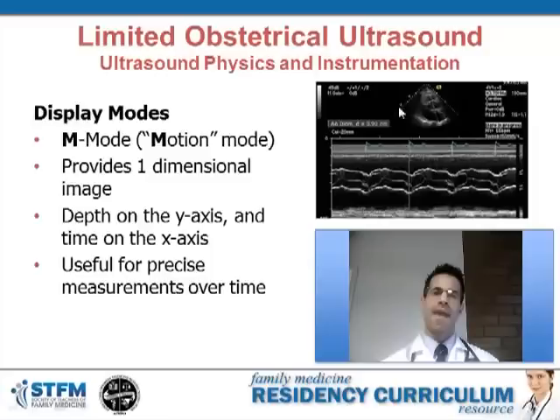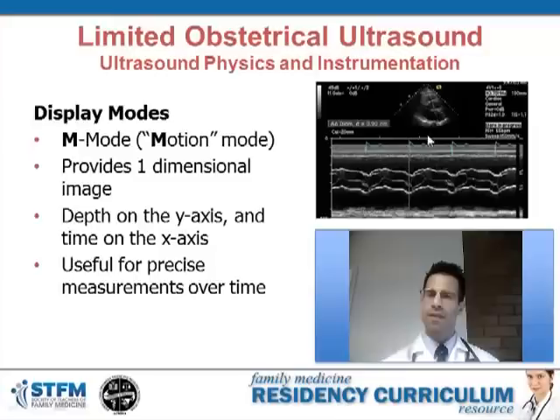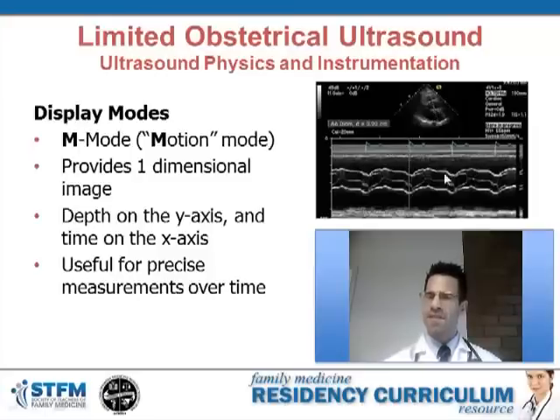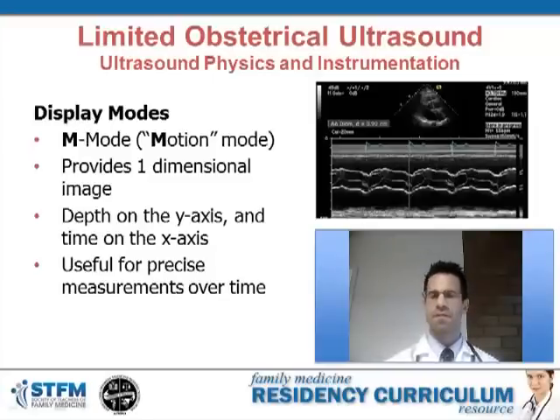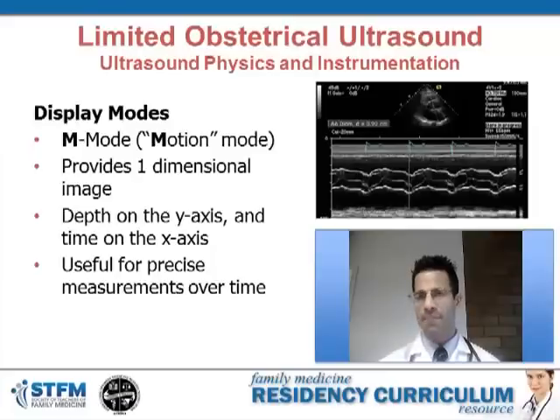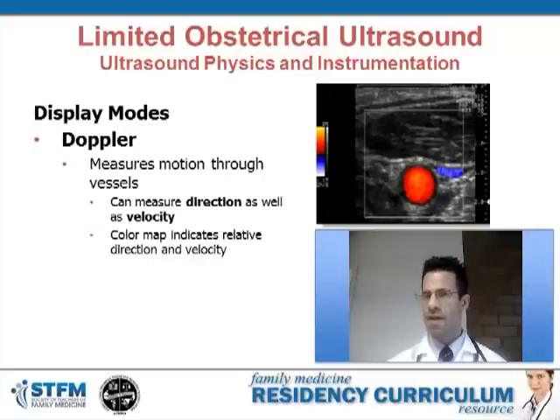Here you can see a parasternal long axis view of the heart — this is the 2D image, and here is the M mode image. M mode takes only one line straight down through the heart; the y-axis represents depth and the x-axis is time. At the aortic valve, it shows the opening and closing of valves in relationship to time. M mode is particularly good for obstetric imaging when calculating the fetal heart rate, and for measuring heart valves precisely in relation to time in cardiac imaging.